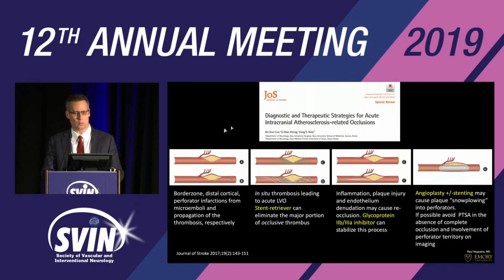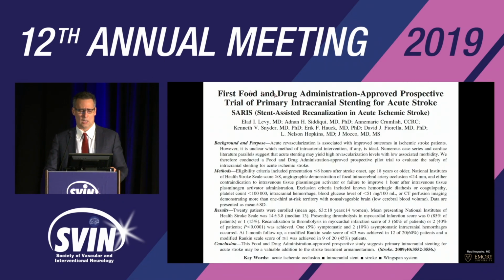Some technical considerations, Jinsu just talked to you. I really like his diagram here. Acute occlusion from ICAD responds very well, and it's very safe to use a stent retriever. We do it all the time. But then immediately you have to load the patient on tirofiban or Integrilin, otherwise it's going to reocclude. You watch, and in many cases you don't need to do anything else, but sometimes you're going to need to do angioplasty and stenting. We know from the SARIS study way back then that stenting is highly effective in acute LVOs.